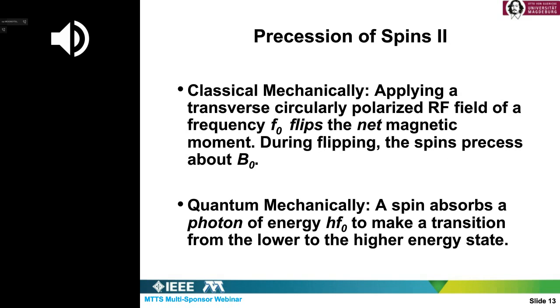It is very similar to a laser, because at thermal equilibrium you have more lower energy than higher energy. You should first invert the population, in which you bring more protons into the higher energy than the lower energy by injecting a circularly polarized magnetic field.